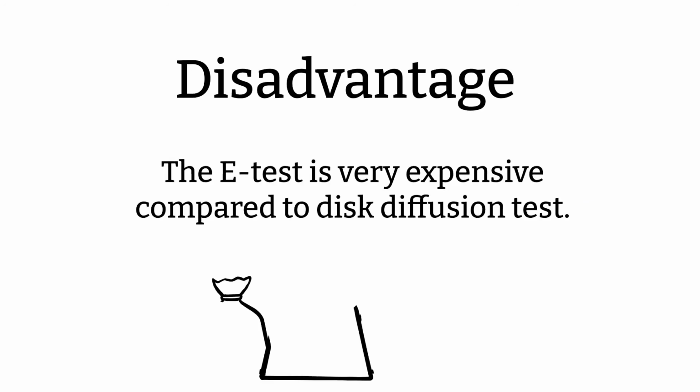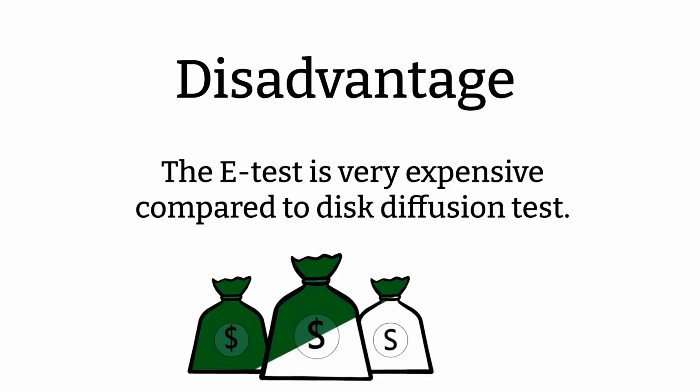Now, the downside of this method is that it is costly. The E-test is really costly compared to its counterpart, the disk diffusion method.